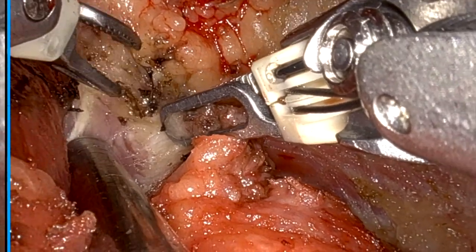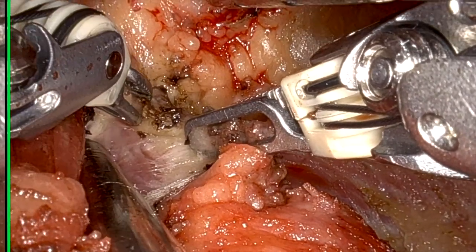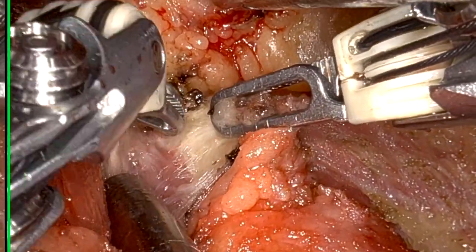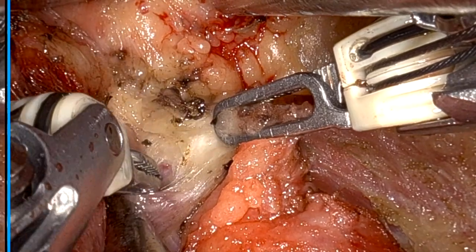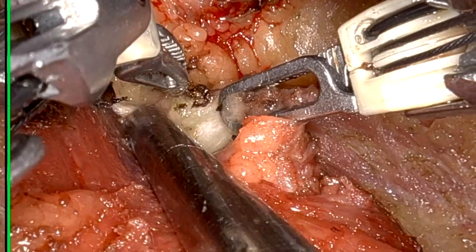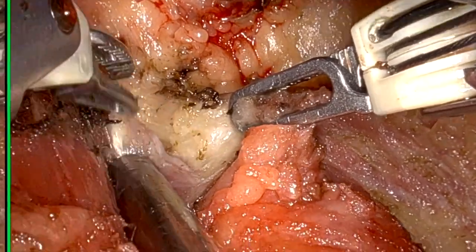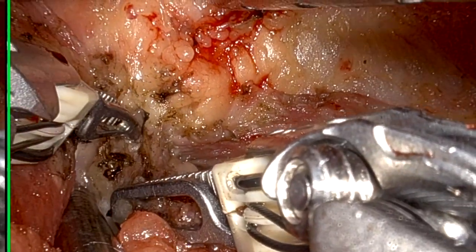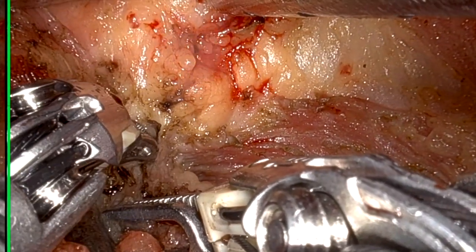You must have one question in your mind. What is the need of this procedure? Why do we do robotic neck dissection? What are the advantages of this procedure? Hidden scar is one definite advantage. Two other advantages, which are not yet studied but I have experienced, are: one, preservation of sensation over the neck area; two, less shoulder syndrome. This may or may not be due to better preservation of cervical roots or less stretching.